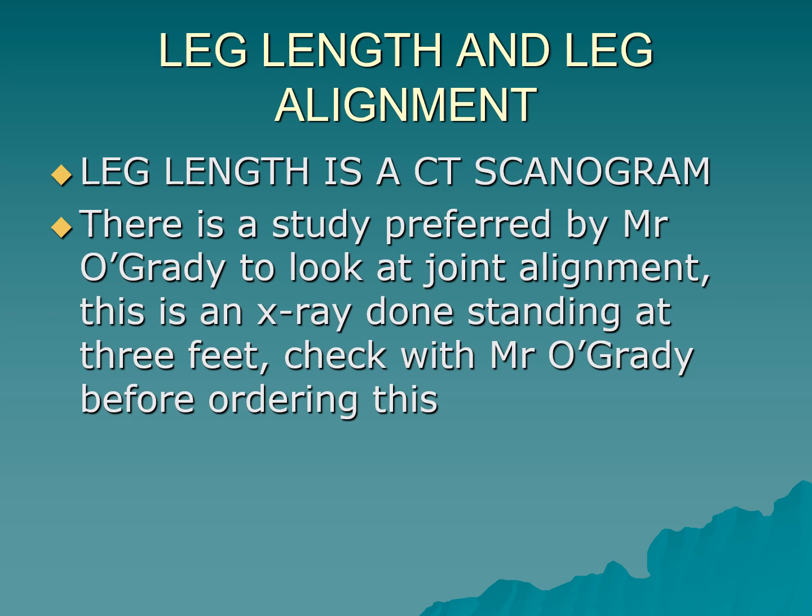There are two leg measurement examinations available. Leg length is a CT scanogram, and leg angulation is a specialist examination preferred by Mr. O'Grady. Please discuss these examinations before requesting them.